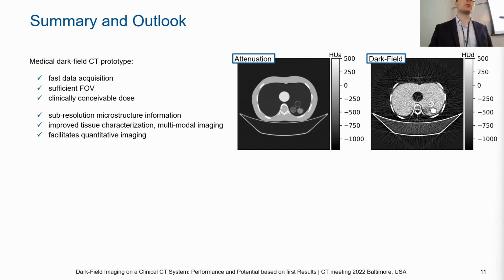Yeah, we have definitely run into some issues regarding the dose we can apply, and the noise level later on, if we measure really large objects. For example, this Lungman has the added possibility of adding more layers outside to make it even bigger, and then we can also fill it with more absorbing materials.